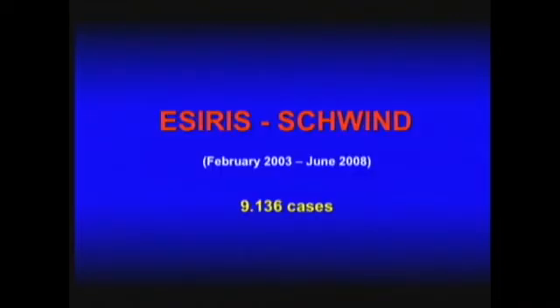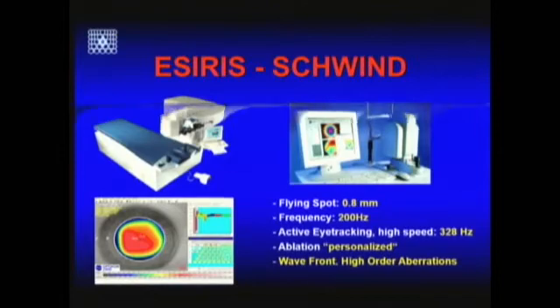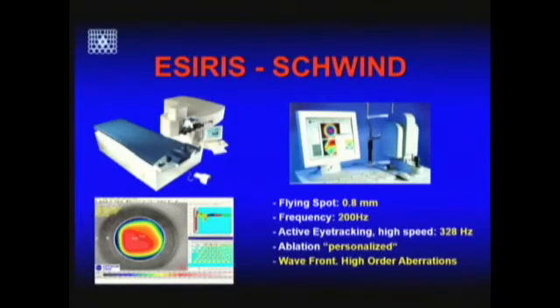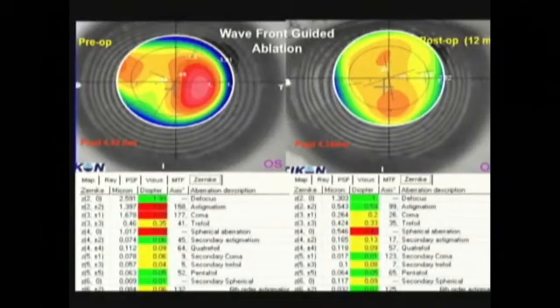Then we started with the Surgeries, and it was the first one which has a flying spot, high frequency, 200 hertz, personalized ablations, because we got Wavefront, and we could detect high order aberrations. At the beginning, we did Wavefront guided ablations for every patient. Bad idea.